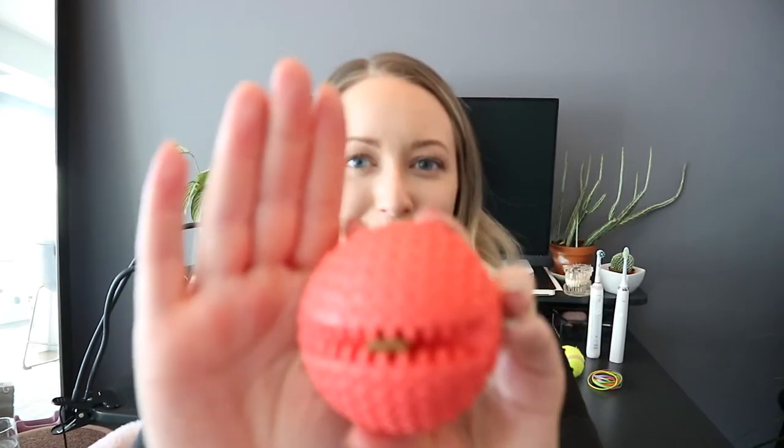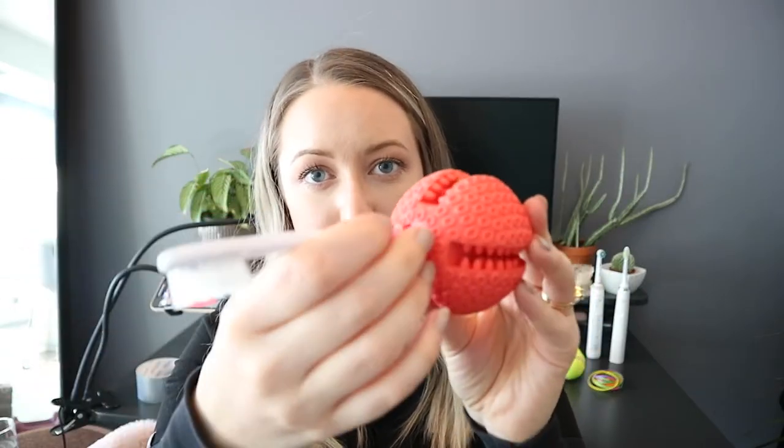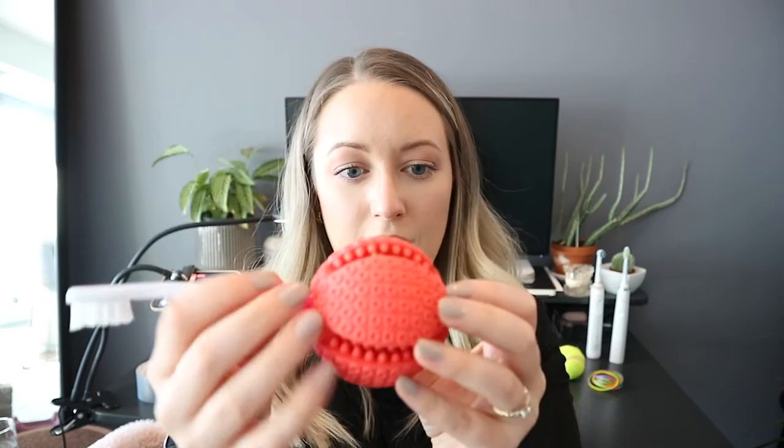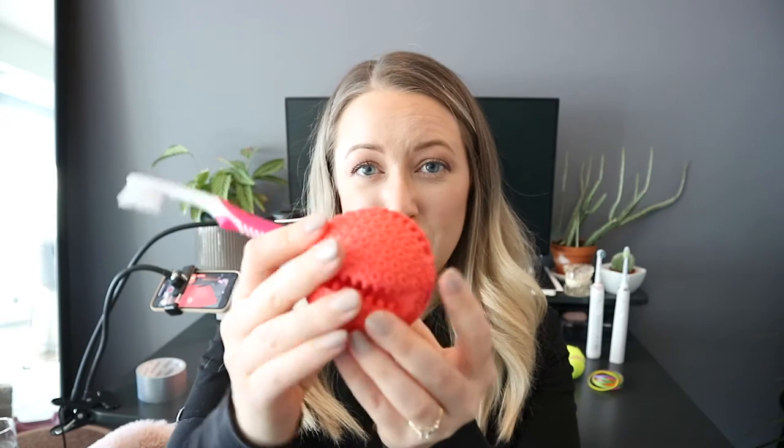Another ball-type modification is to use a dog toy or cat toy. You can take your toothbrush and put it right through the hole, similar to the pool noodle — you might need to tape the end so the brush doesn't go all the way through. This one is heavier though, so it depends on the strength of your arm. It might not be ideal for everyone, but you can try it out.